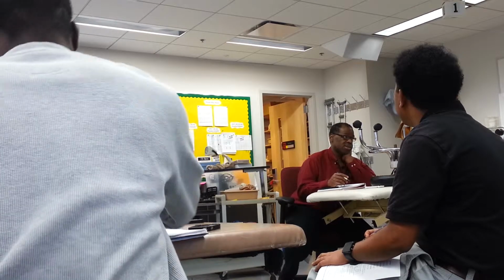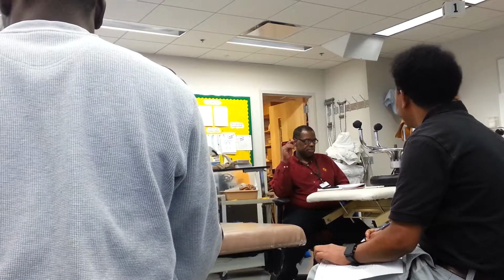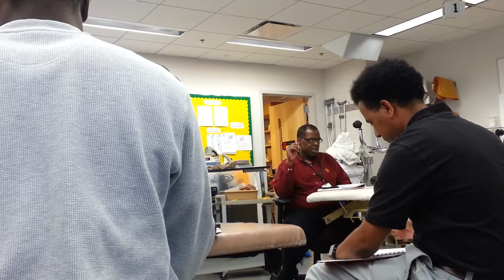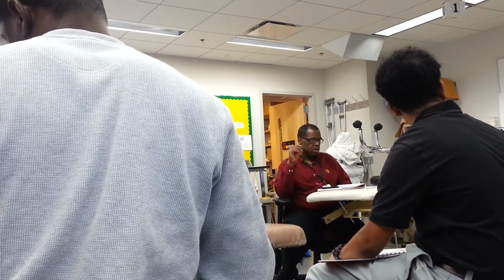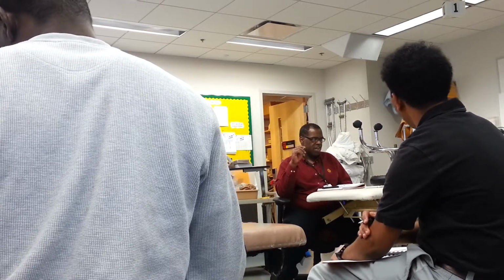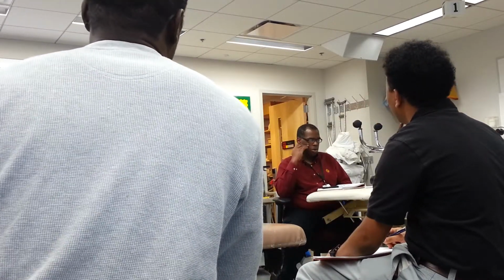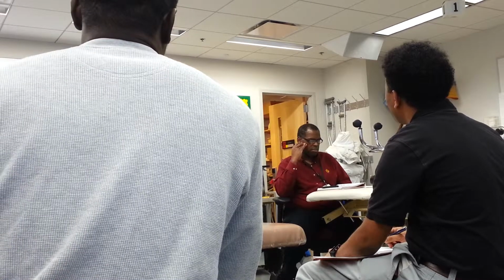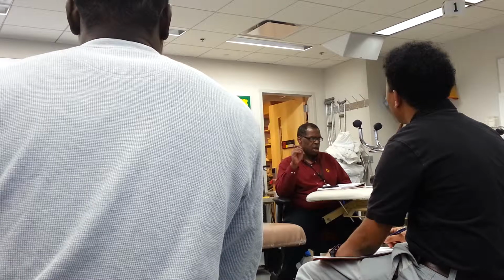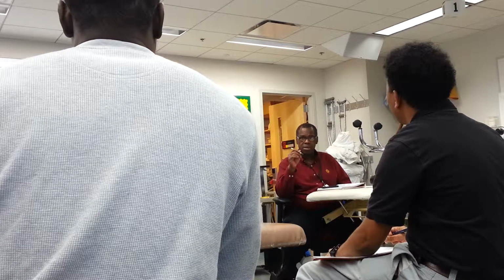50. Now, if I set the machine on a pulse rate of 100 and a pulse width of 50, I'm going to get tingling.